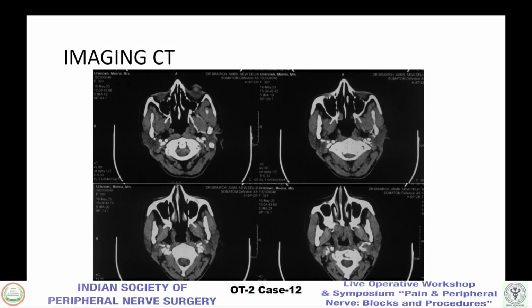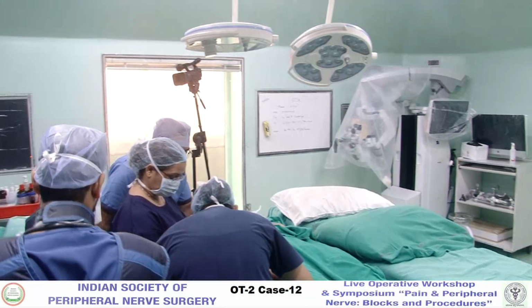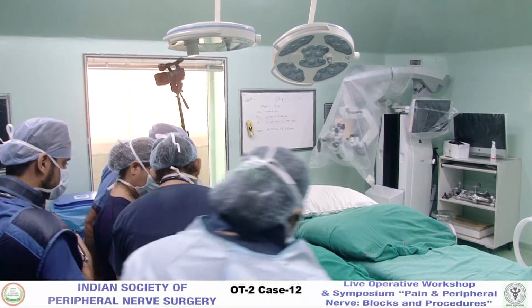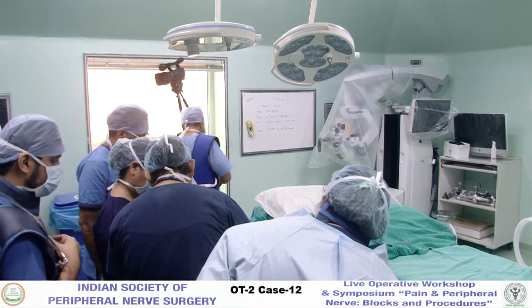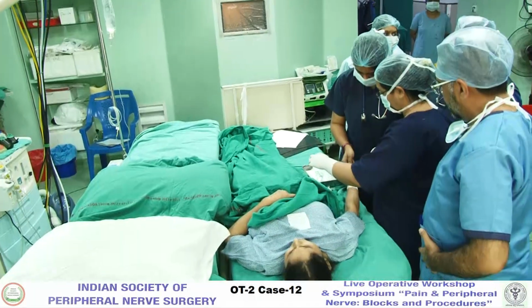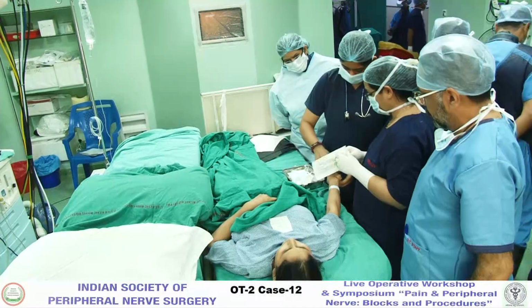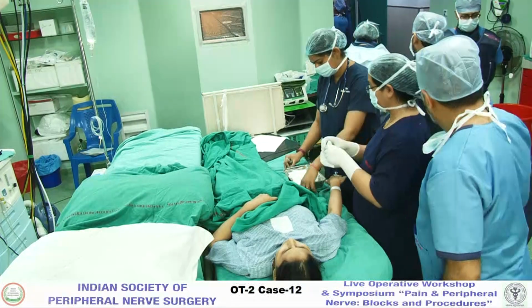All right. Yeah. And so I'll pause my mic for a while so that I can give instructions here. Okay. We can have the OT view so that we know what's happening. Can you focus on the patient? Yes, sir. Greater, sir. Yes, sir. Ah, very easy, sir. We have done that.